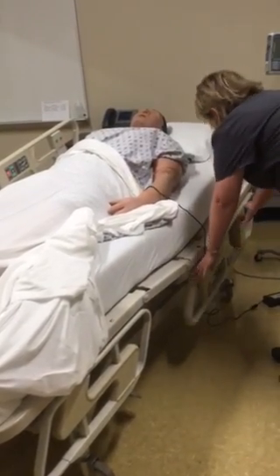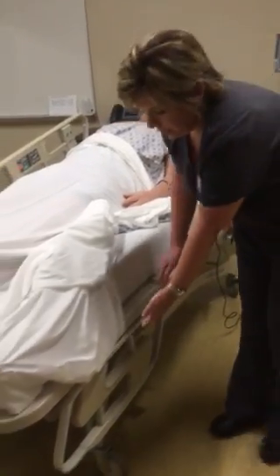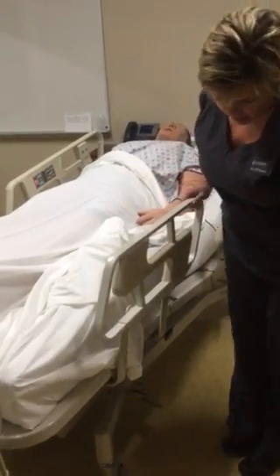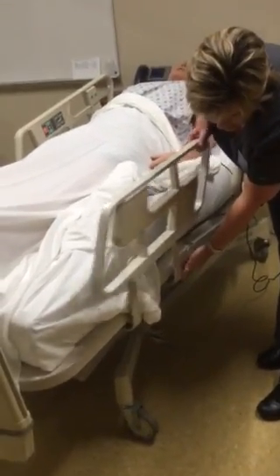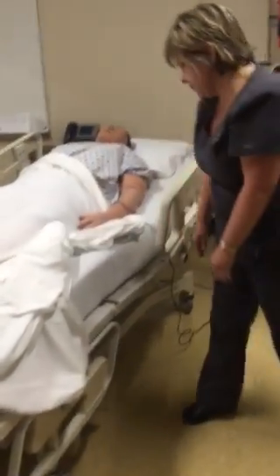You may then push that underneath if you need that to be out of the way. The foot rails are very similar in that you're going to raise them as such, and then you have the release button to lower them and go under the bed.